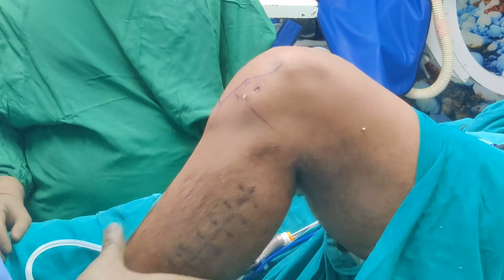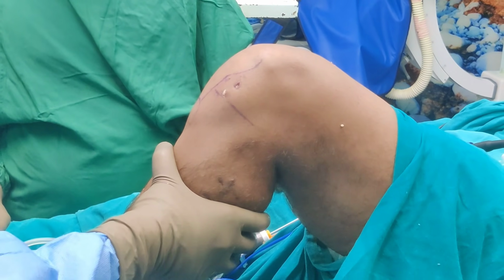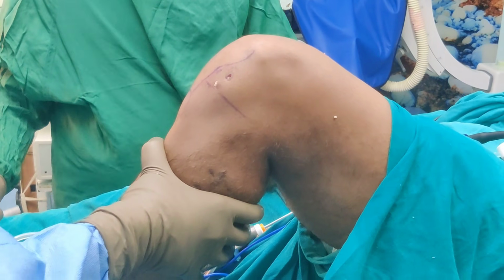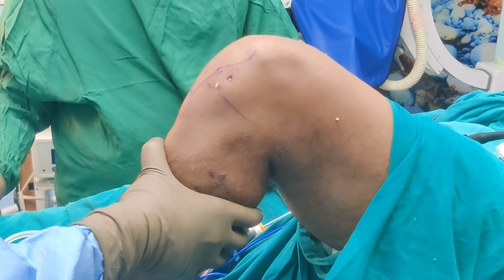So now we have tightened it. You can see the sag is completely gone and the posterior draw test is completely gone. So this is an excellent result. Now I'm just going to put my scope inside, just giving a good wash, and then it's just a matter of closing the portals and starting the rehab from tomorrow.